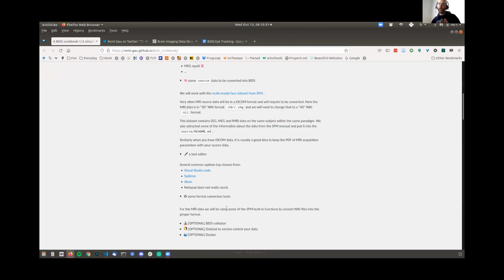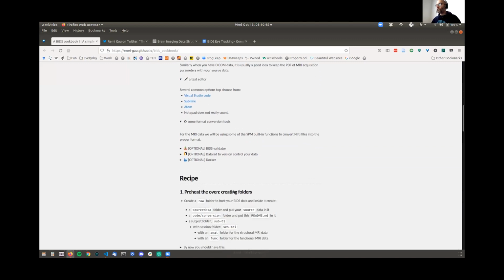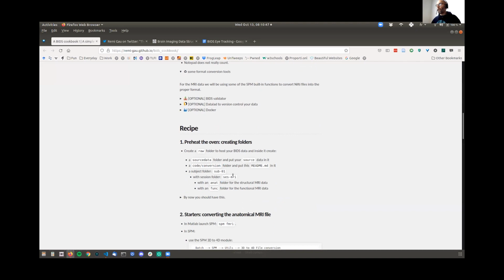In this case, I'll just be using MATLAB and SPM to show you how to do it. Once again, if you're dealing with real fMRI or MEG or whatever type of data you're using, use proper converting tools to do this. That will definitely make your life easier.